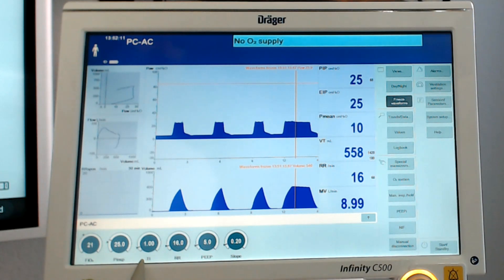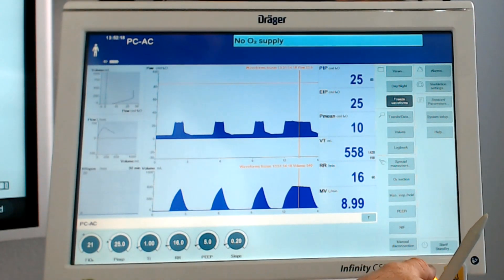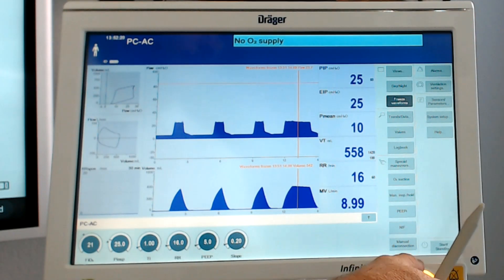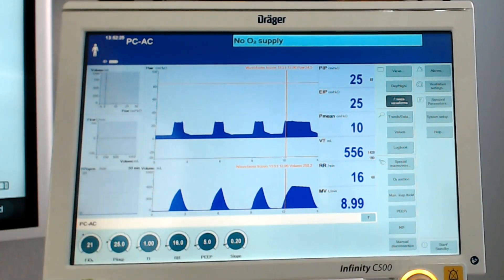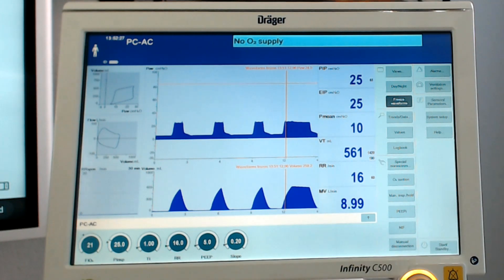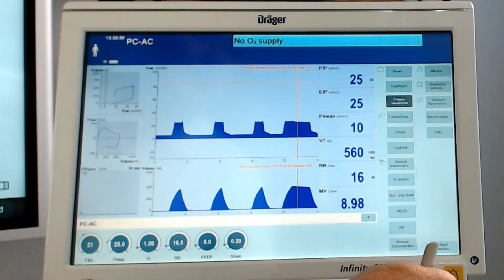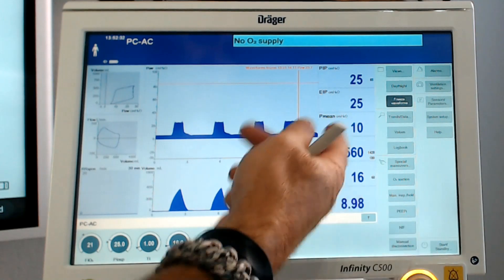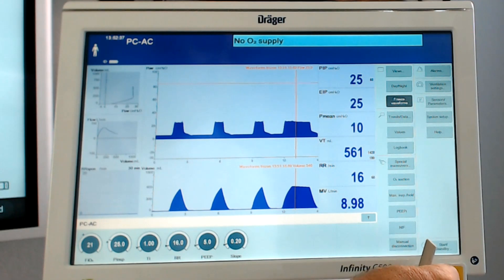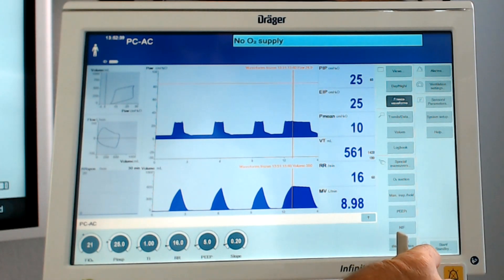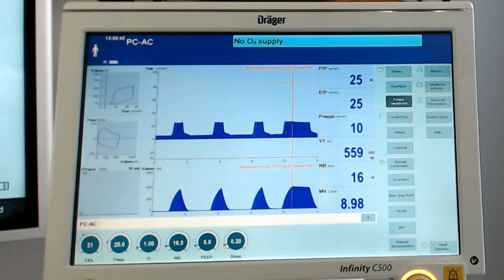We have 25 set, and we have an I-time of one second. So the ventilator says, you want me to do an inspiratory hold? I'll just hold this pressure at 25, which is also going to be the peak inspiratory pressure. So our peak inspiratory pressure is indeed 25. We get a slight drop to a plateau pressure of 24. Our tidal volume at baseline is 550 milliliters.